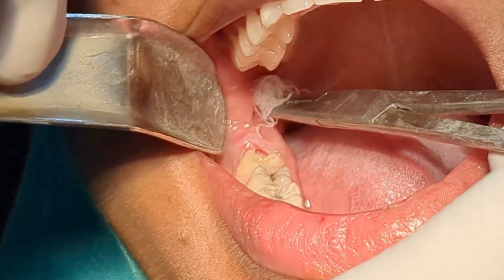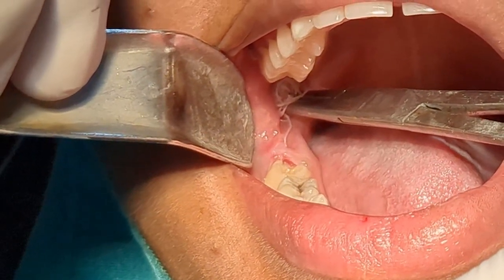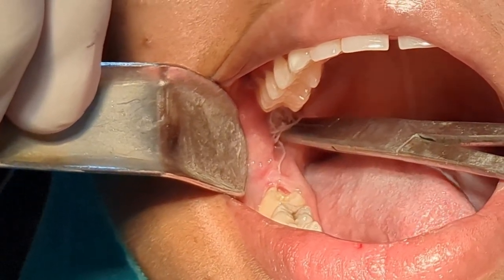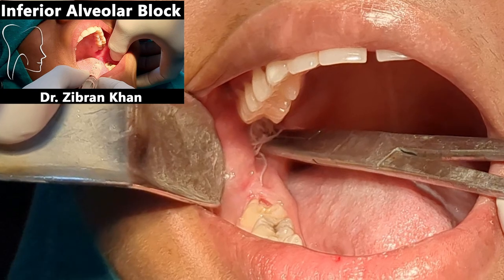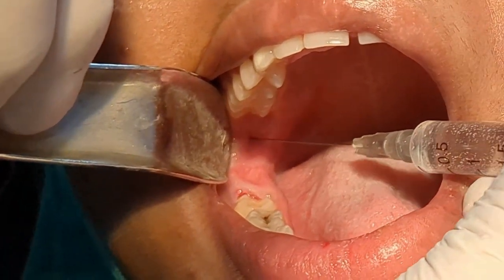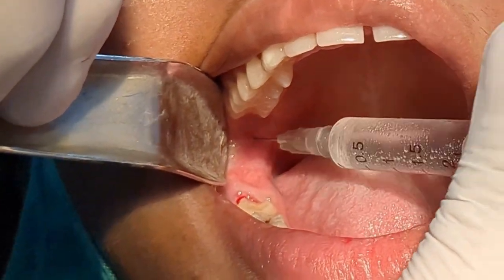I am applying pressure using a small gauze soaked with topical anesthetic. The site where I am applying pressure is the site of needle insertion for the inferior alveolar nerve block. You can watch my other nerve block videos on the channel for further explanation. I insert the needle for the inferior alveolar nerve block, aspirate in two planes, and deposit the LA solution.